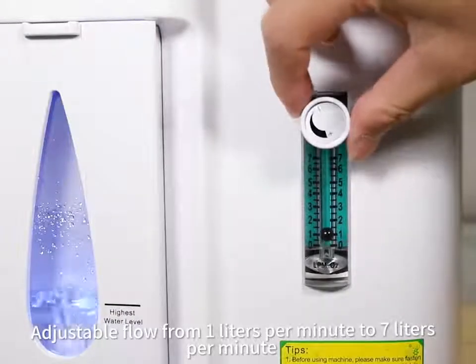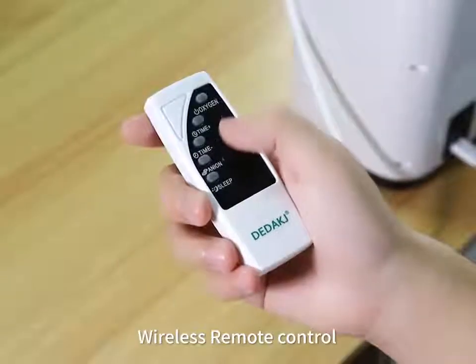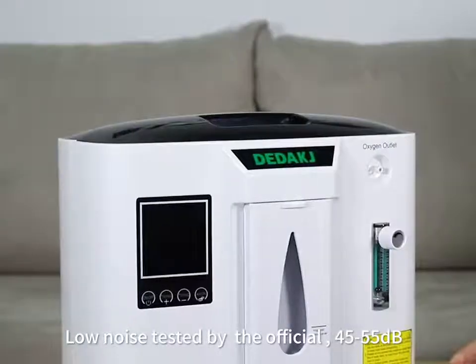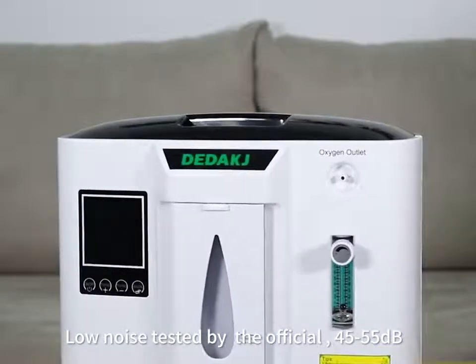Adjustable flow from 1 liter per minute to 7 liters per minute. Wireless remote control. Use easily and comfortably. No noise tested by the official: 45 to 55 decibels.